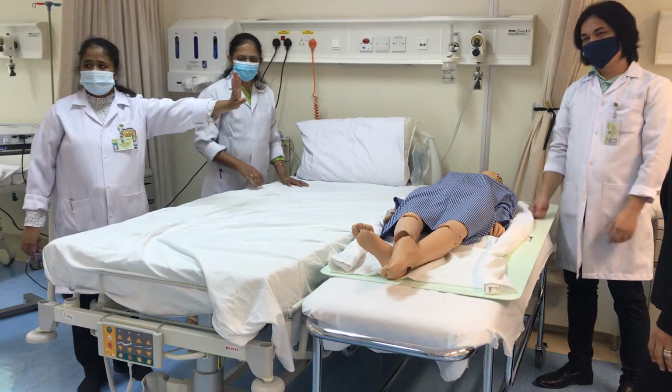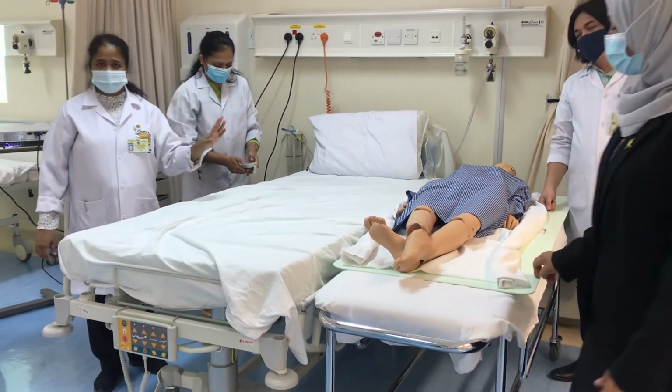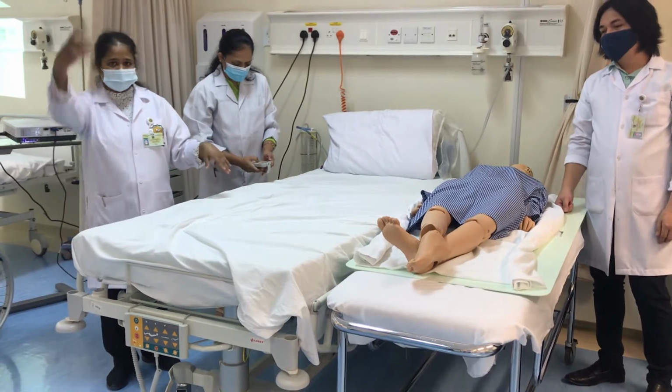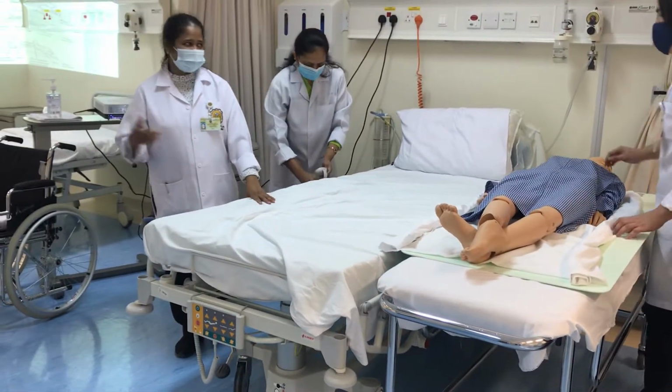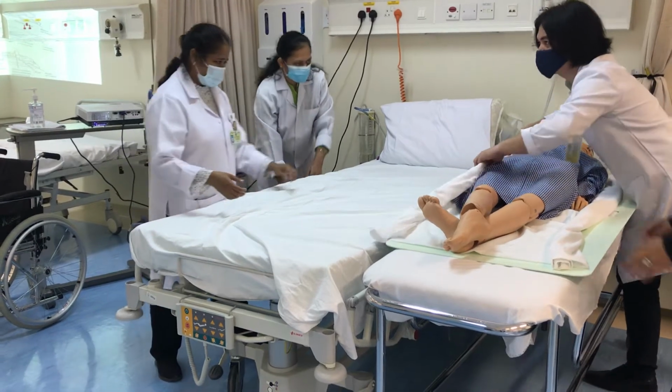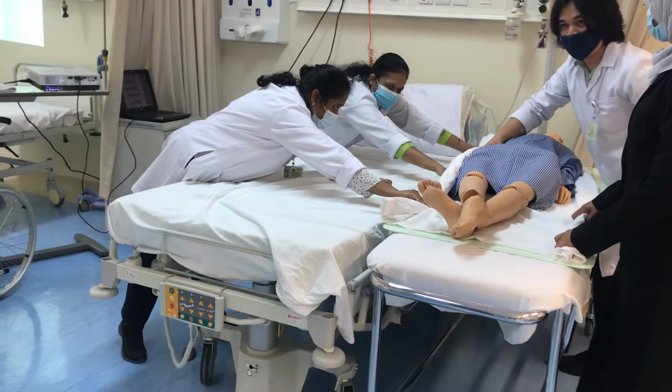Every ward has this butt slide. So they are using this in the hospital. So even if you don't do the first method, do this. Because the book says all methods, we are telling you how to do it. The last one is the manual, without the turn sheet and without the butt slide.